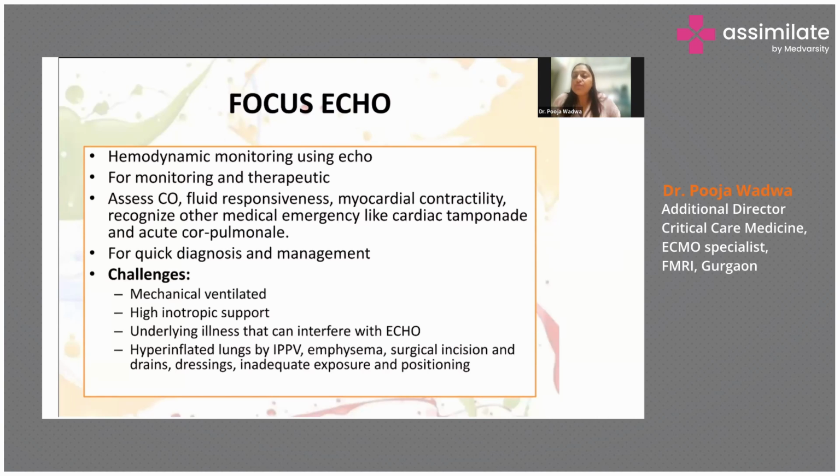Now, as with any other modality, it has certain challenges. In patients who are mechanically ventilated and on high inotropic support, the hemodynamics are all altered, so you do not expect the echo findings to be the same as those of a normal patient.